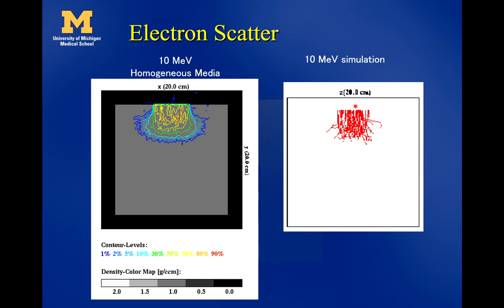This electron right here came down through the patient, took a turn, and went outside, and it basically creates what we call an elephant foot style dose distribution. Right near the surface, the dose is very much constrained to the actual shape of the cutout that we have. But when we get deeper inside the patient, it splays out quite a bit, and we get what you could call an inverted mushroom. Some people call this an elephant foot type dose distribution, where the dose bulges out quite a bit.